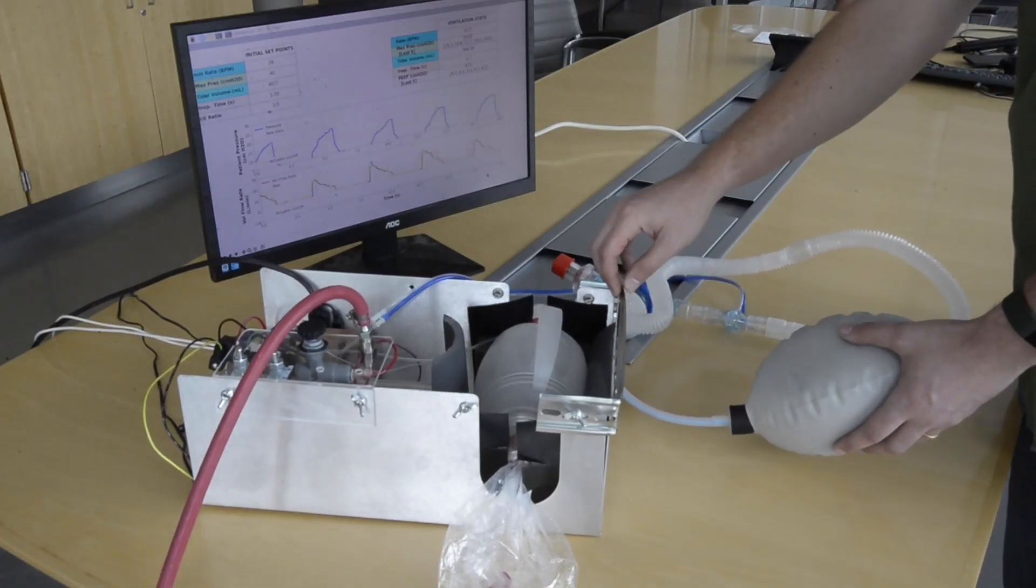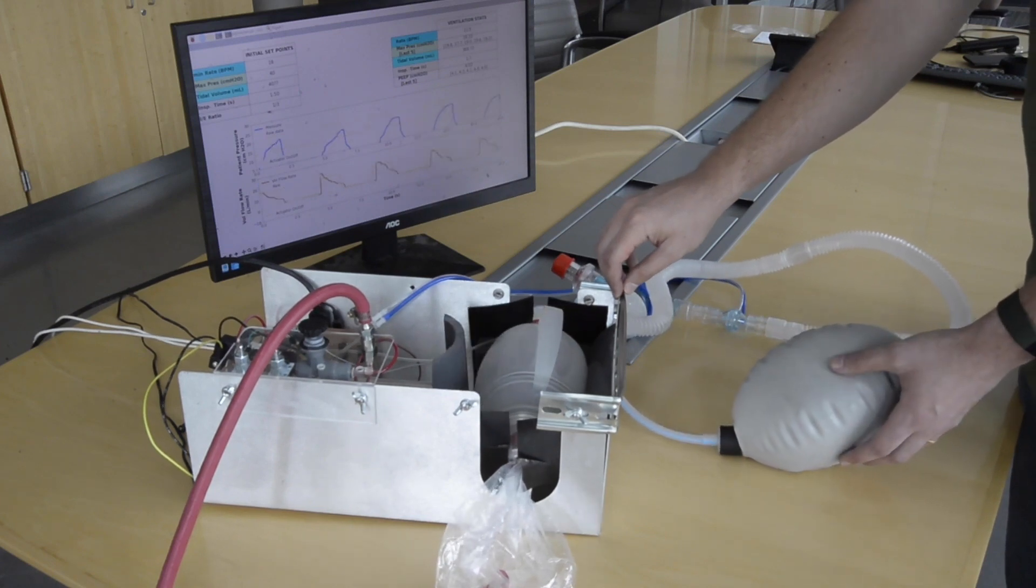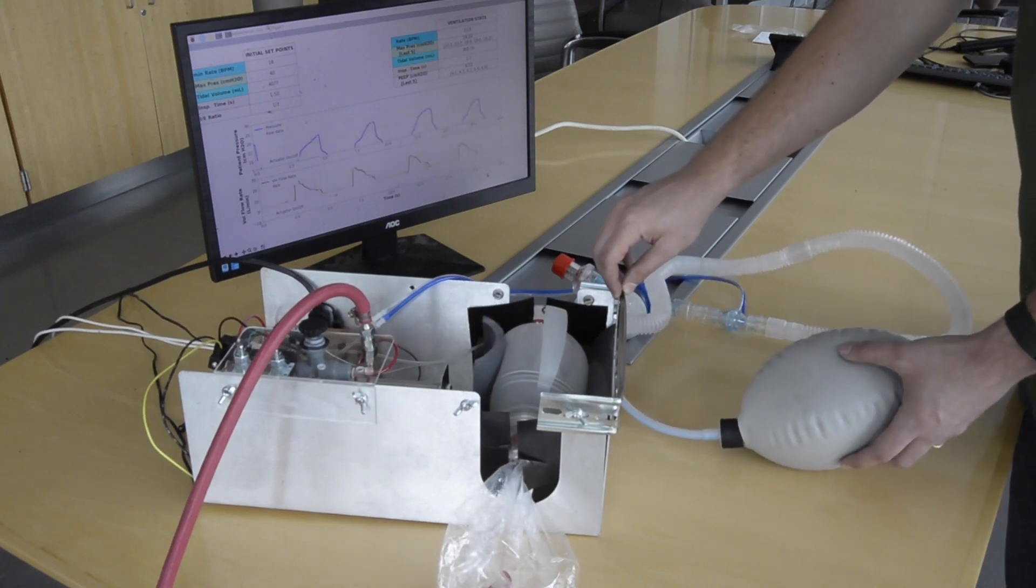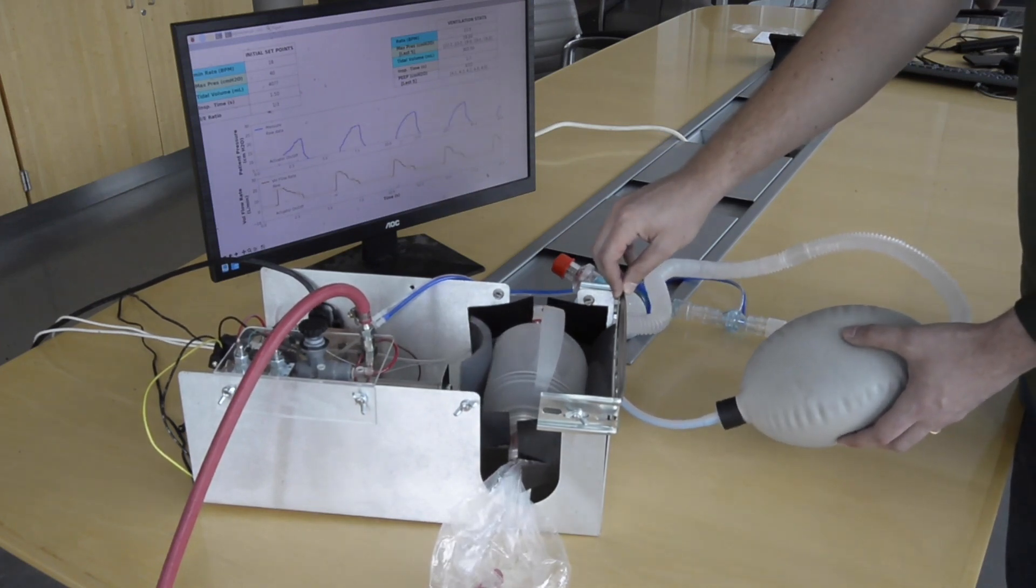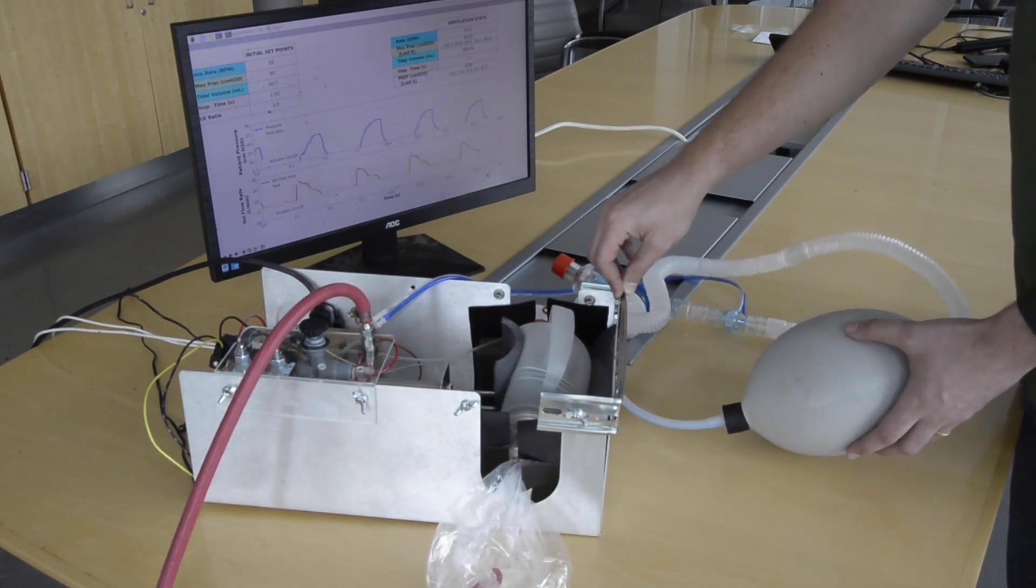The ventilator can normally operate on a fixed duty cycle. However, it also has overpressure protection to sense when the patient pressure is too high and to immediately stop a breath.